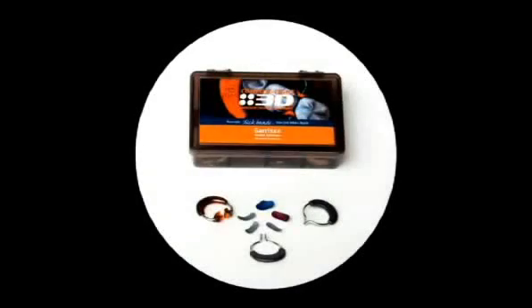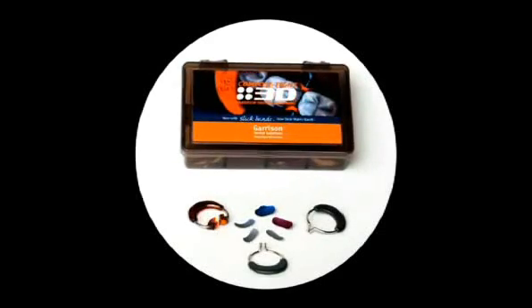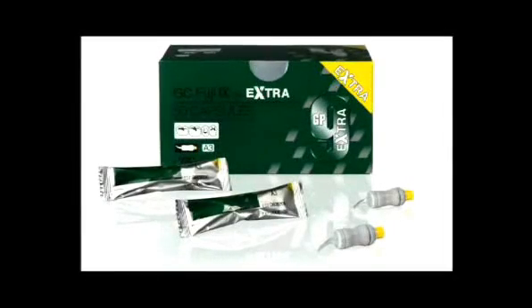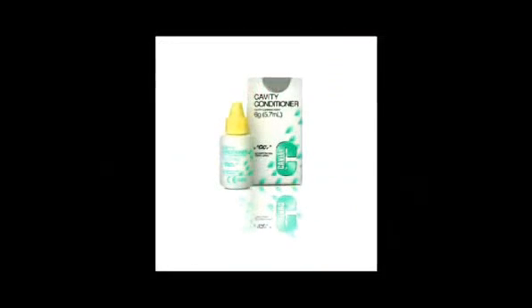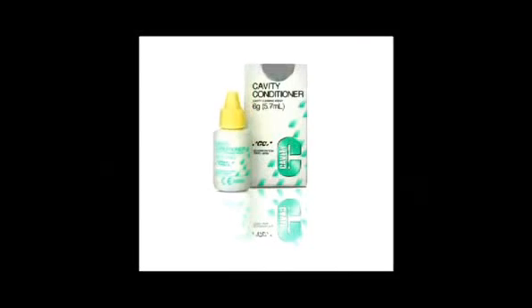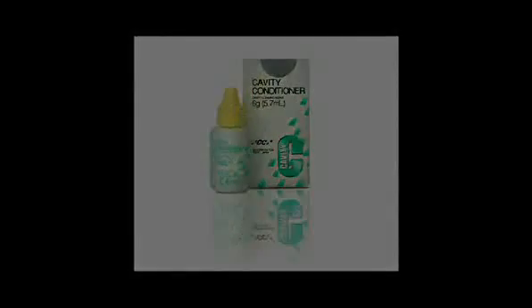A sectional matrix band was used to develop optimal contours, gingival seal, and ideal proximal contact. Since a self-adhesive glass ionomer was selected, Fuji IX GP Extra, a cavity conditioner is not required. Although the conditioner is not required for adhesion, this conditioner, a 10% polyacrylic acid, removes the smear layer and any contaminants and can provide an additional micromechanical retention.